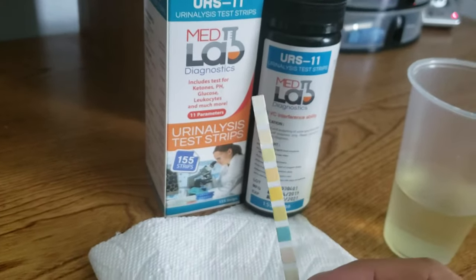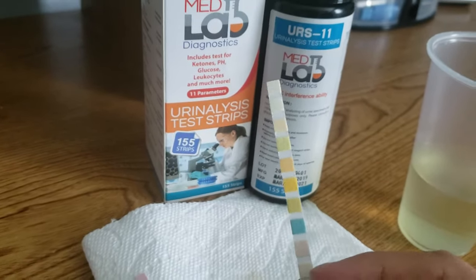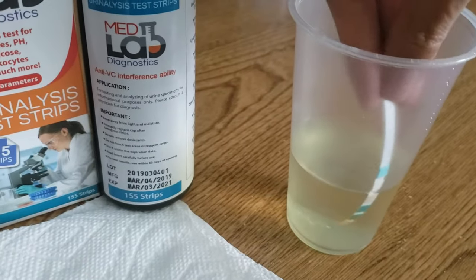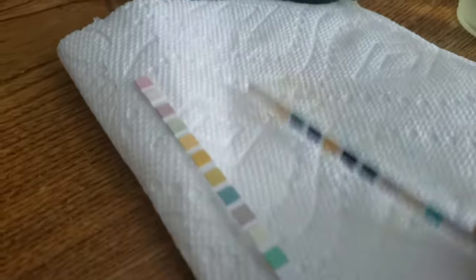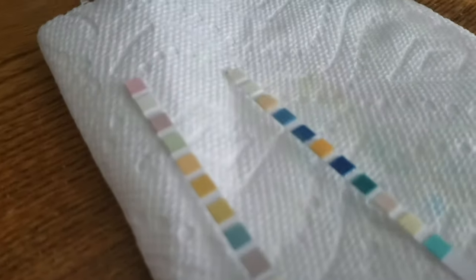So now that we have our strip here, we're going to do a test and then check our results on the pad against the color chart that's on the bottle. We have a test solution here. Make sure you get your strip completely inside the liquid and remove any excess liquid. Take it out and then lay it down on a flat surface and wait the indicated number of seconds before you read your results.